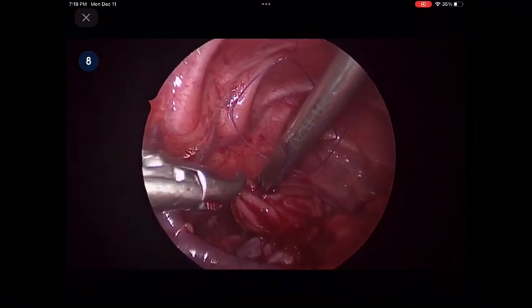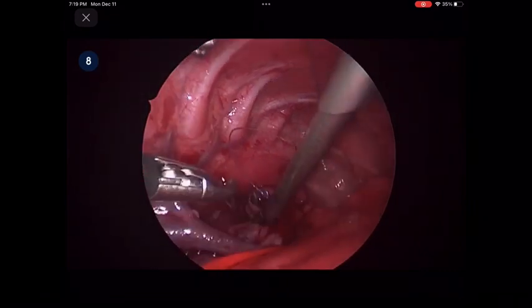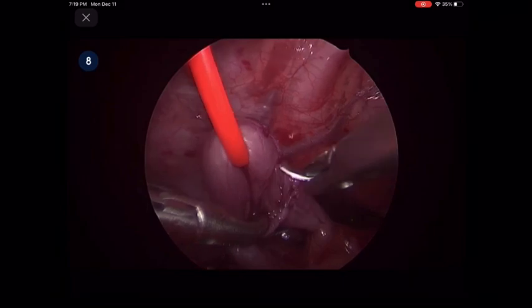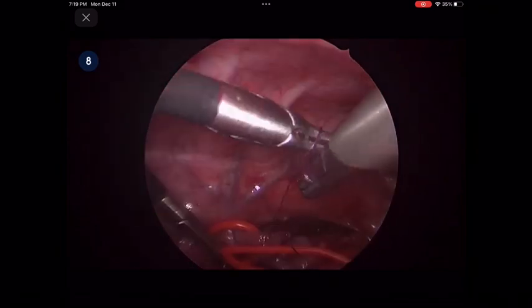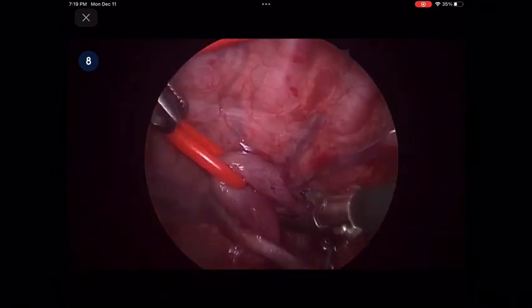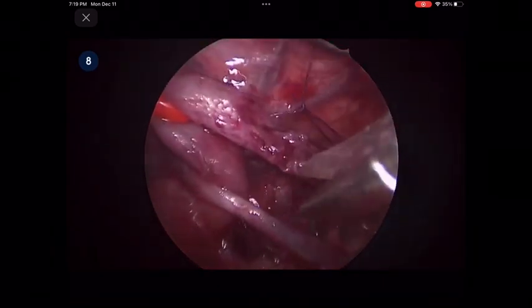Ensure that stitches incorporate sufficient mucosa, but bites are small enough not to involve too much of the muscularis. Place a second stitch through the corresponding wall of the distal esophageal section. Next, divide the fistula completely, completing the transection using scissors.